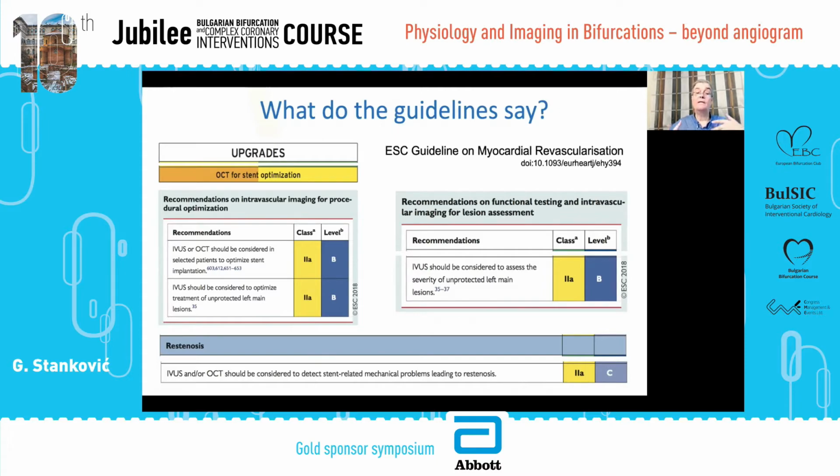I believe it's much, much more useful to start from the very beginning: assess the lesion, plan the strategy, guide the procedure, and optimize the result. In such a case, we will really reach the full benefit.